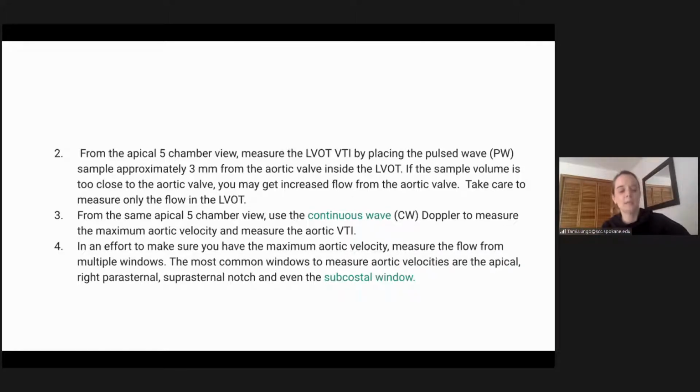They're going to look because that's what we do as a protocol, but they're going to know that their best window is where you recorded it. So we make note of that. It can be a high right, suprasternal, subcostal, or apical, depending on the patient. So it's just nice to record that data for the next person. Are there any questions with that?